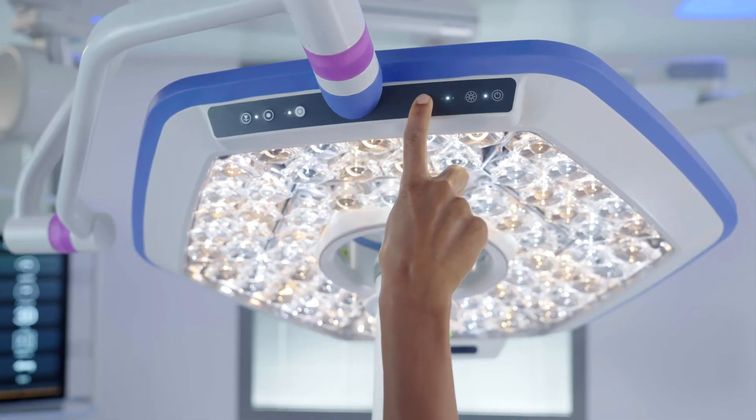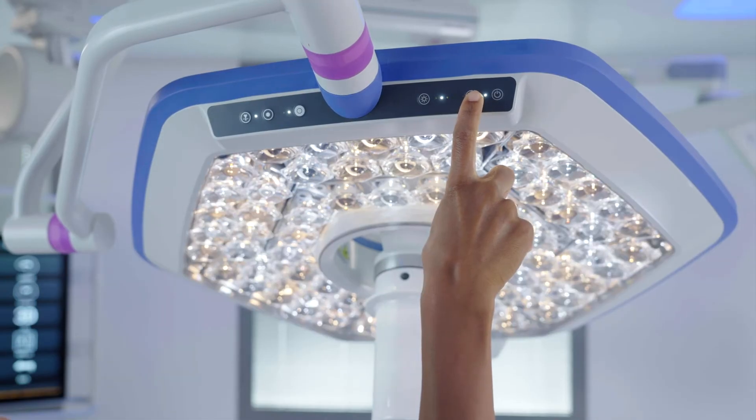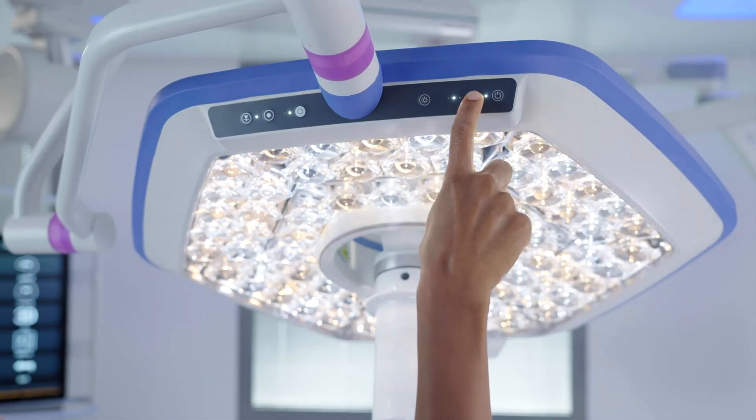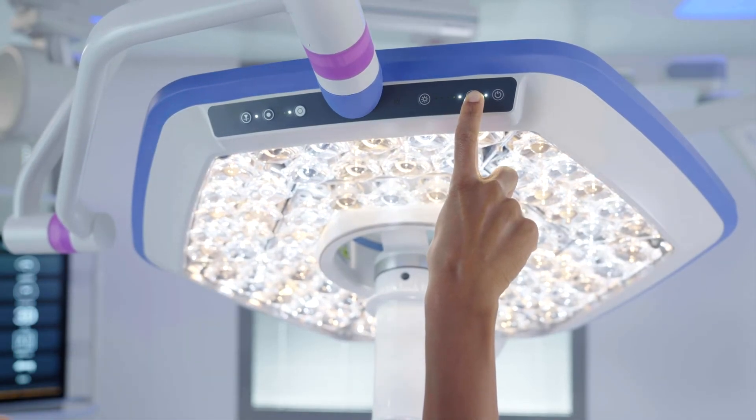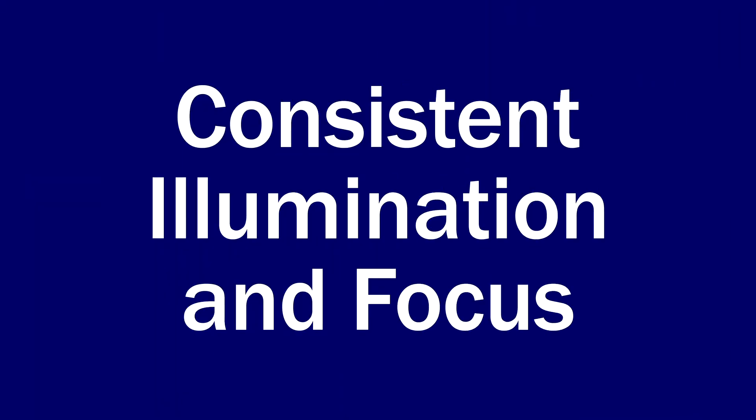The controls on the side of the light head include a power button and brightness adjustment, which allow you to adjust the intensity from endo mode or 10% intensity up to 100% intensity. The Helix Pro Surgical Light includes four levels of brightness from 30% to 100% intensity, as well as an endo mode or 10% intensity.